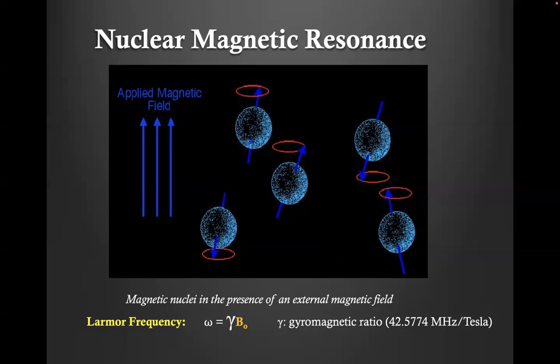And something important is the Larmor frequency, and that's related to the gyromagnetic ratio. If you remember, we showed in the previous table. So depending on the gyromagnetic ratio, as well as the main magnetic field, all these protons are going to precess or spin at a Larmor frequency, omega. And then this omega changes with main magnetic field. So namely at 1 Tesla, 1.5 Tesla, or 3 Tesla, it's precessing at different frequencies. And that's important because that's also the frequency that we are receiving our signals at.